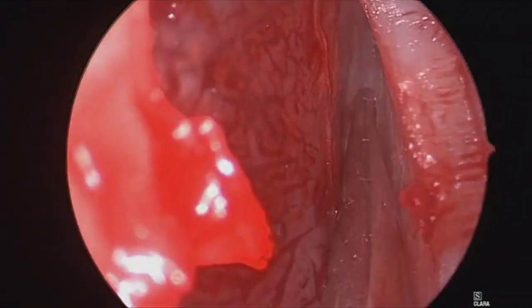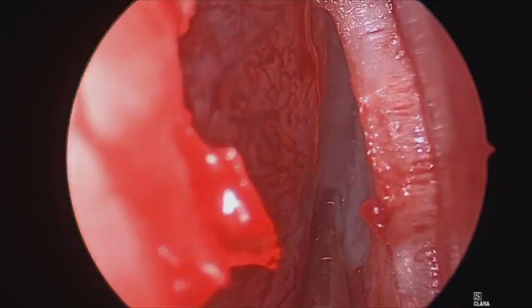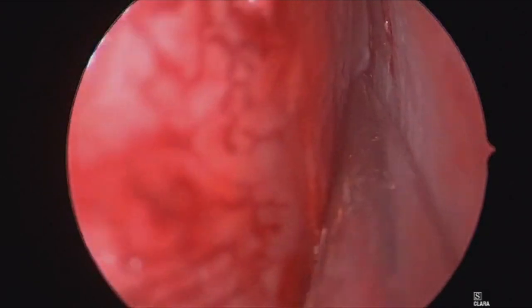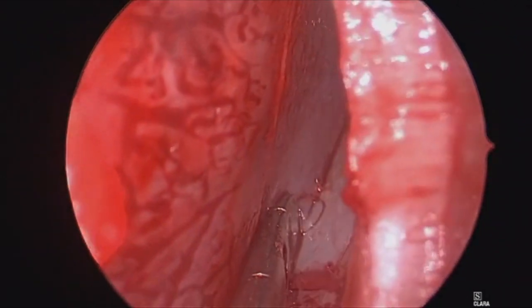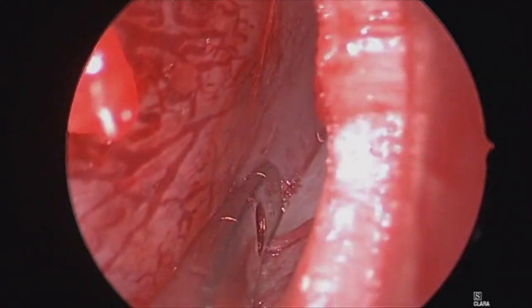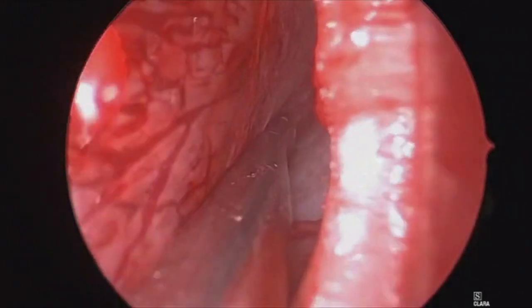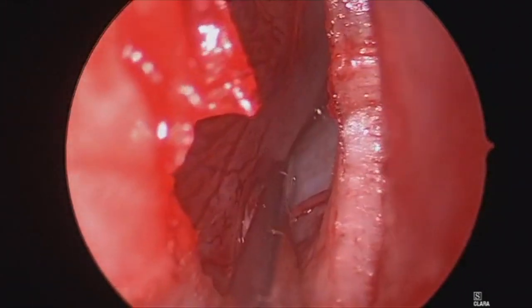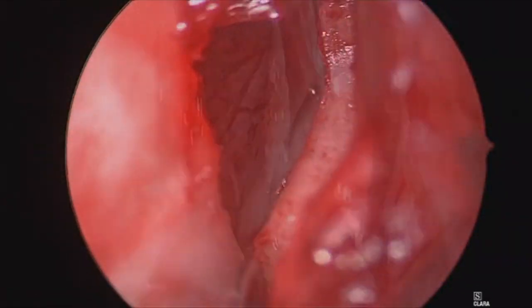The key parts in this elevation are ensuring that the primary pressure you're putting is actually on the cartilage and bone, which will subsequently lift away the flap for you. The idea is not to push on the flap itself, which will reduce your risk of a tear. Here we are dissecting on the right side down towards the floor of the nose to where the cartilage meets the maxillary crest.